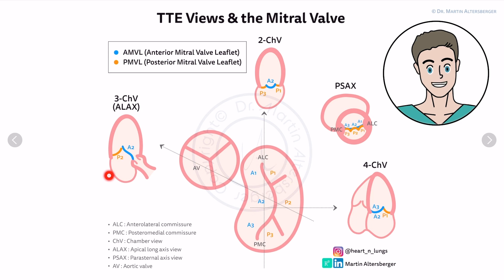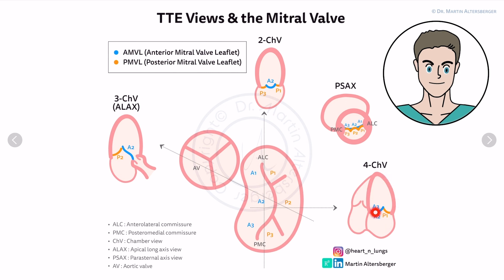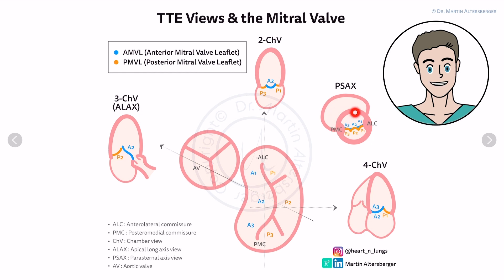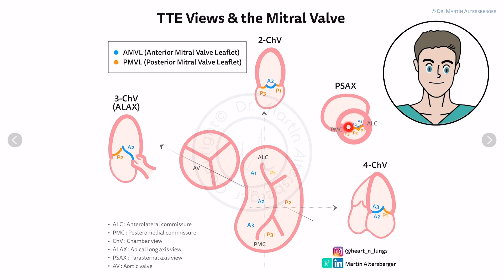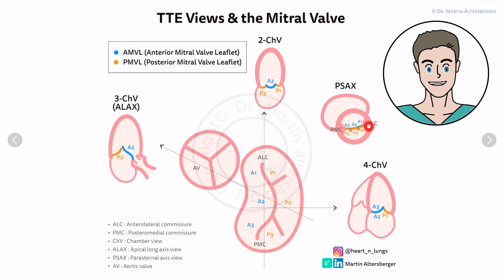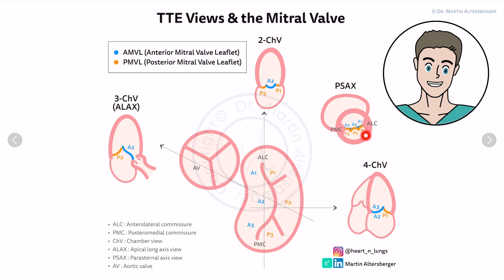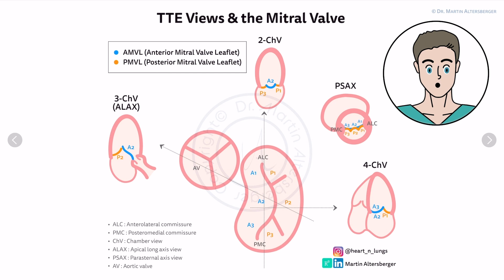As we can see in all these views — the apical long axis, apical two chamber, and apical four chamber — we can always see parts of the separate leaflets of the mitral valve. But in the parasternal short axis, you can see the entire mitral valve and all the leaflets with all their parts. This is the posterior medial commissure and the anterior lateral commissure, and you can count A3, A2, A1, P3, P2, P1. So in the parasternal short axis view, you get an overview of the entire mitral valve.